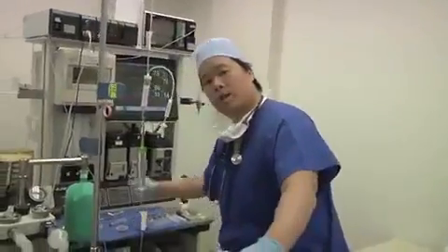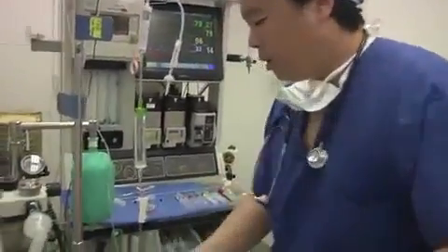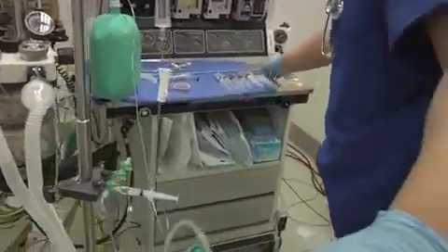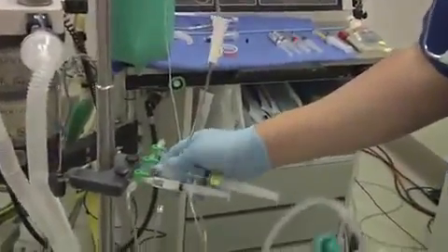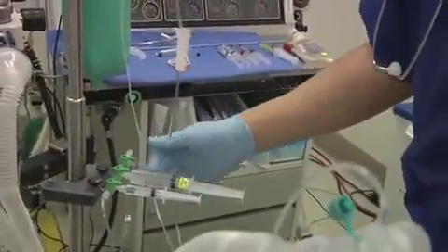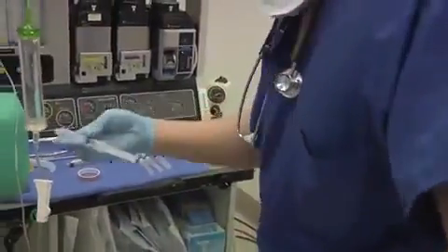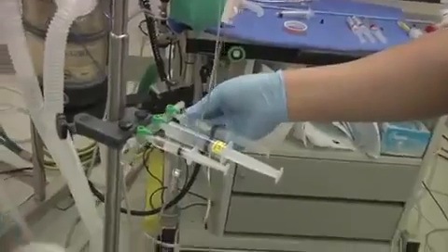While I'm pre-oxygenating, I'm going to go ahead and attach my syringes to the manifold. We typically will use an opioid, fentanyl. I'm also going to attach propofol here to the manifold. This is fake propofol. We ran out of real propofol in the simulator today, so this is fake propofol, but you get the idea. And then also we're going to attach our neuromuscular blocking agent, in this case vecuronium.